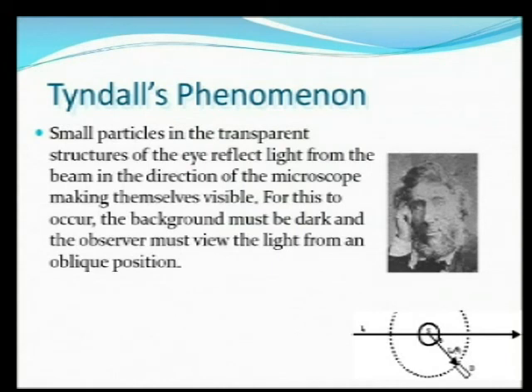But really, when we're talking about a slit lamp, we're talking about illumination, and we're talking about magnification. So in its simplest form, you could take a flashlight and a magnifier, and you've got the elements of a basic slit lamp. What really makes things different between just an illuminated magnifier and a slit lamp is our ability to see subtle changes, particularly in transparent structures.